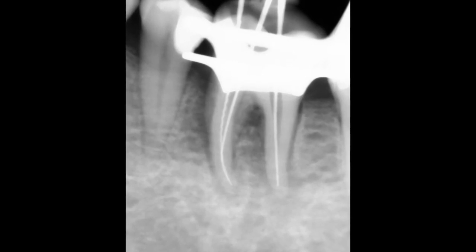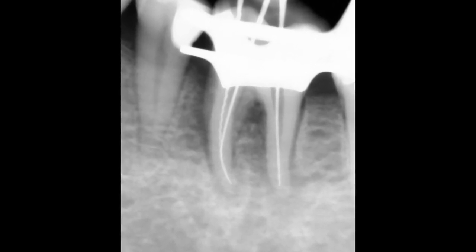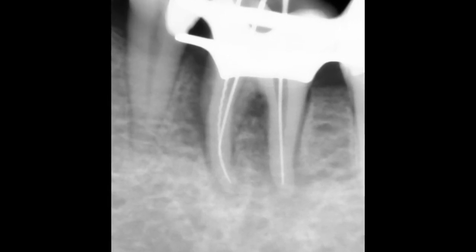If you take a radiograph with the instruments at the apical level indicated by the machine, you will see that they are slightly short of the radiographic apex, usually 1 to 1.5 mm. This distance may vary, however.